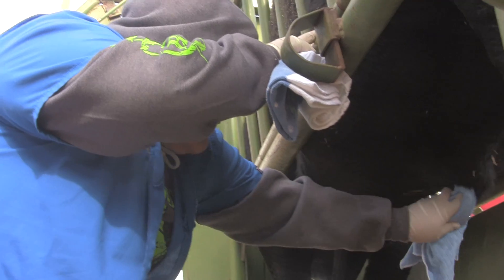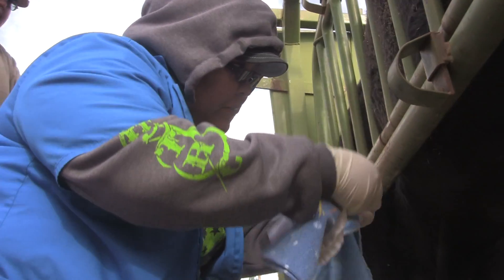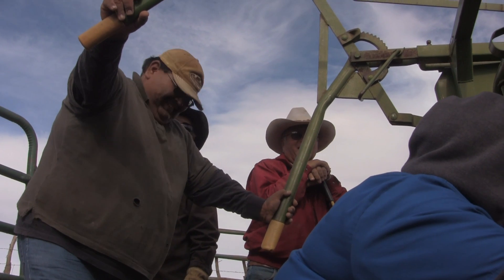My name is Martina Martinez. I'm a vet tech student here, a second year, so hopefully I'll be done in the spring. After this, I plan to go to vet school and become a veterinarian. Today we did some trick bull testing — we did about five bulls today. But he doesn't like what's fixing to happen. I don't blame him. I don't either, by God.